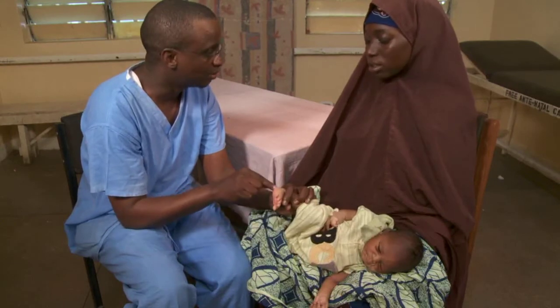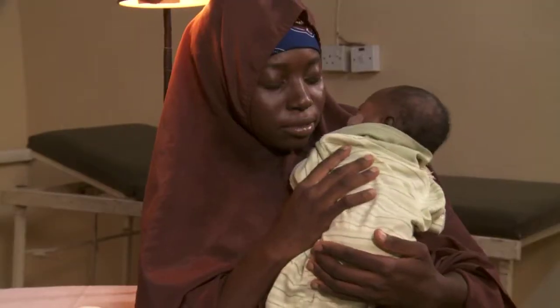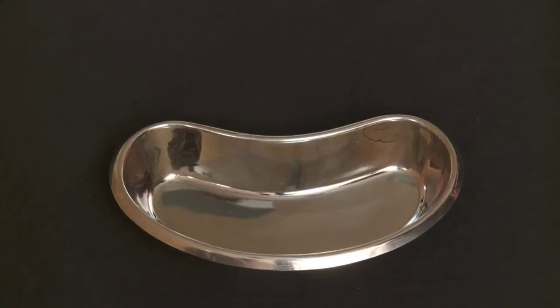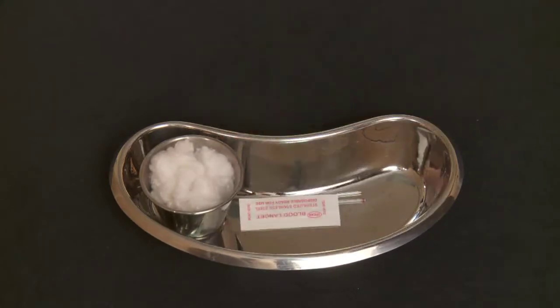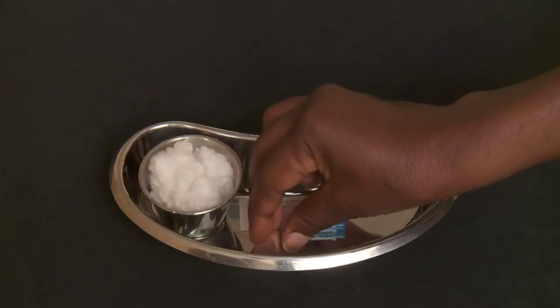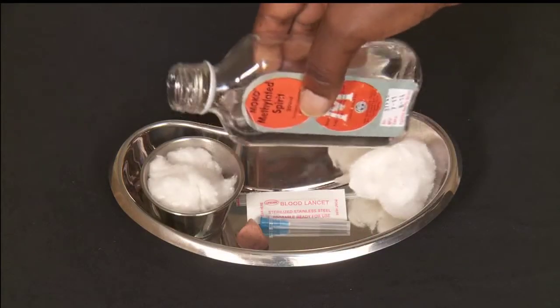To begin, let the mother know how this will be done. Encourage her to comfort the baby to distract him from the pain. Then gather your supplies: cotton swabs, capillary tubes, a sterile lancet or 24 gauge needle, and plasticine. Pour antiseptic on the cotton and remember your gloves.